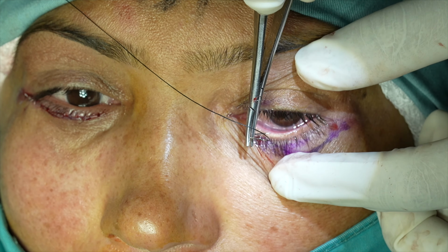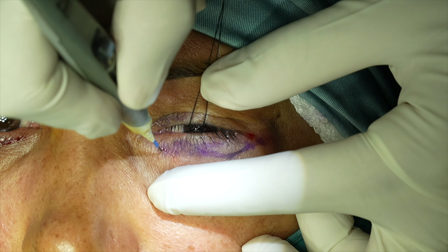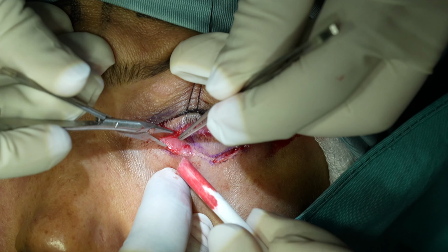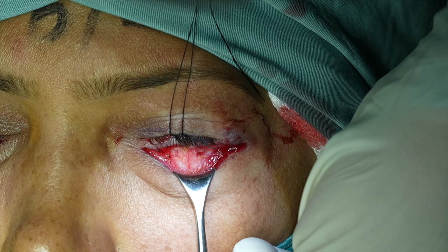The same procedure is repeated on the left side. The skin is excised using Colorado needle. The septum is opened using a blunt scissor.